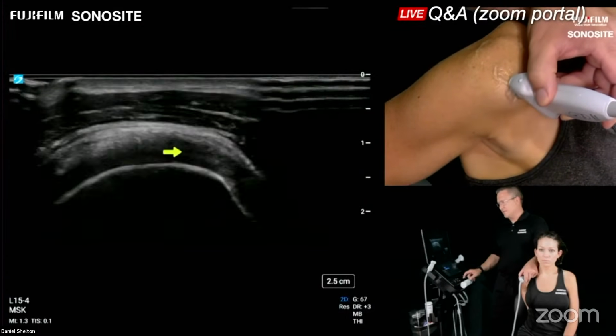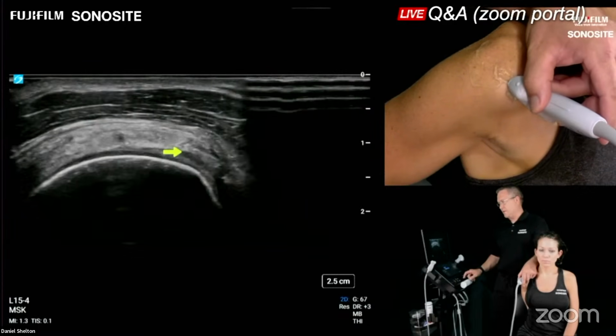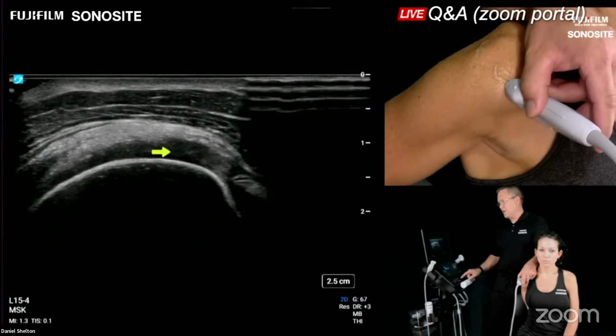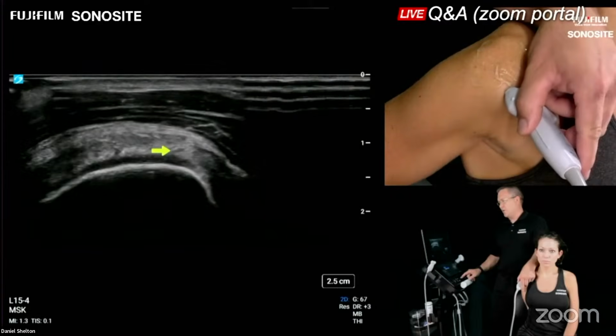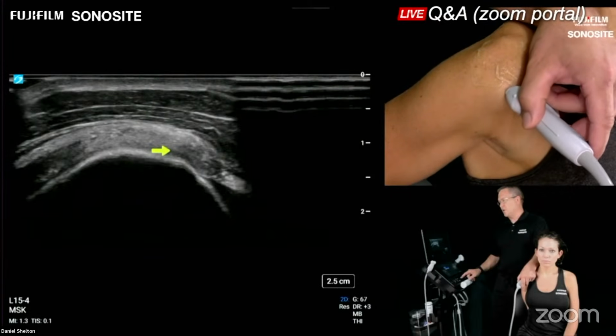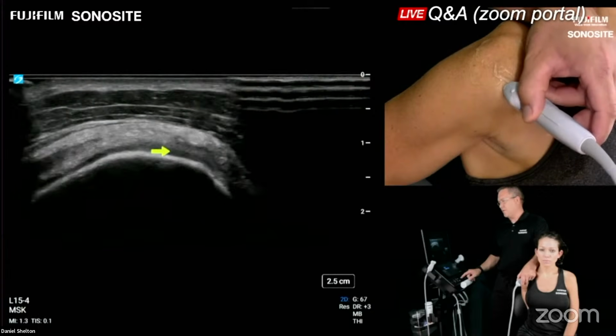I'm going to go distal. You'll see the tendon disappear. I need to drop the handle back into the tendon. Go distal, see the tendon disappear, drop the handle back into the tendon. You're going to keep walking that down. We did something really similar in the carpal tunnel webinar when it came to all the anisotropic connective tissue artifacts that we had within the tunnel.